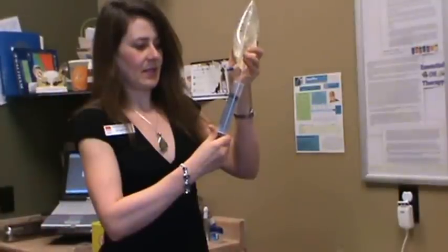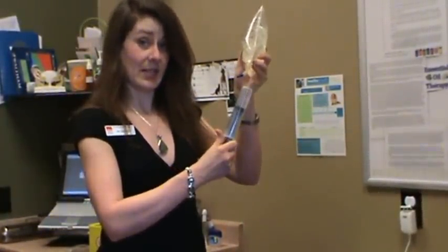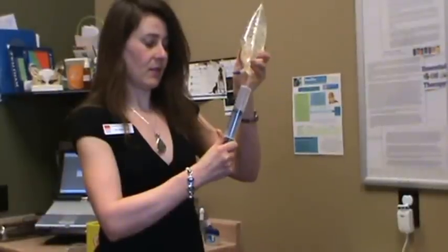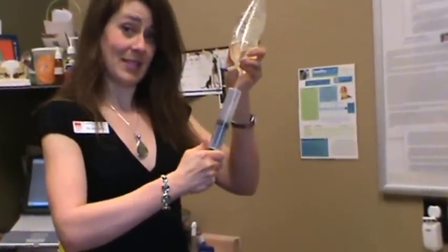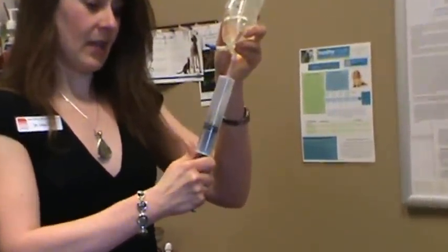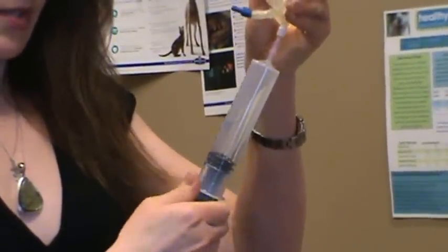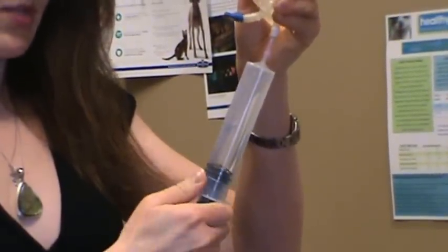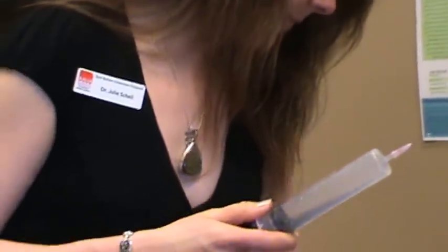Usually I will dispense a program for about 60 milliliters twice a day under the cat's skin. For most cats, once they are more hydrated they go down to maybe 60 milliliters a day and then we can even go downwards from there. Sometimes some patients are on it only once a week. We also use a vitamin B injection for him, so we'll show you how to give a vitamin B injection as well.